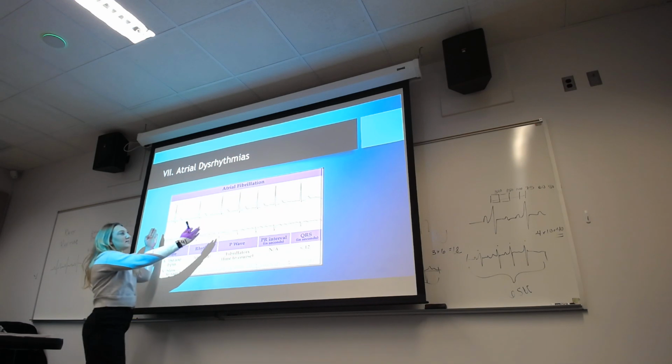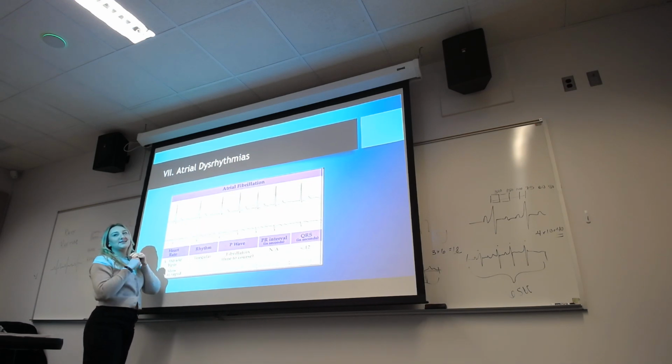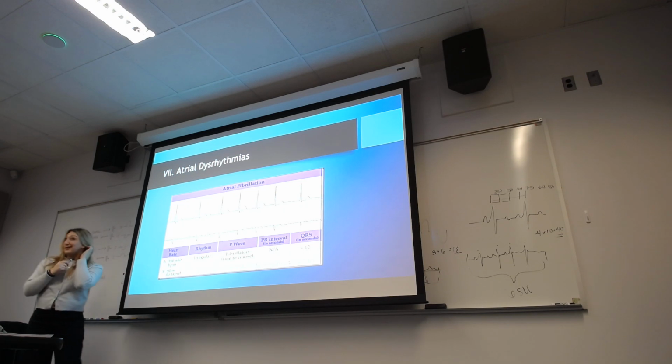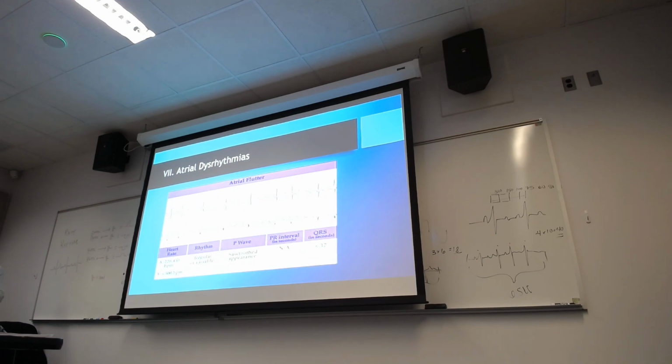So you are more likely to count your QRS complexes with that one, or look at the top of the paper and see what it said. So the 300, 150, 100 method just doesn't work as well there.